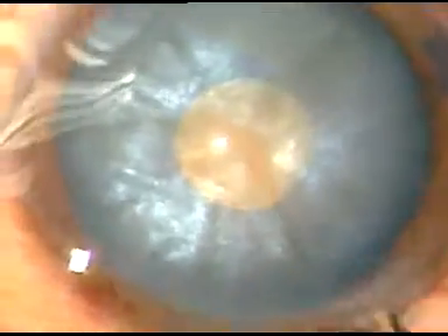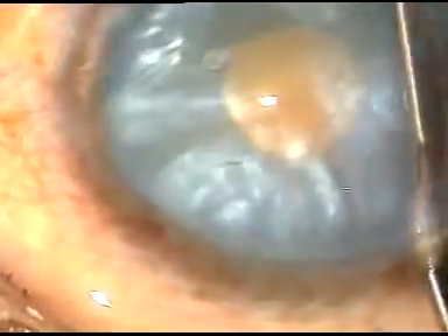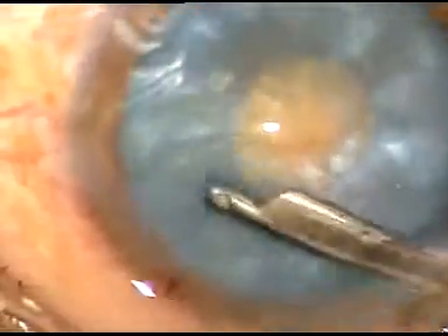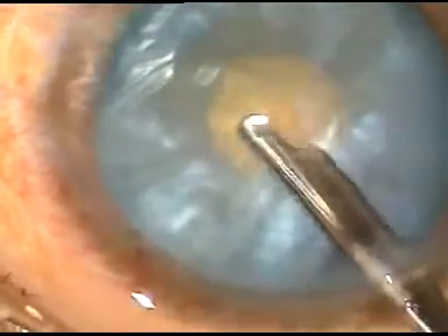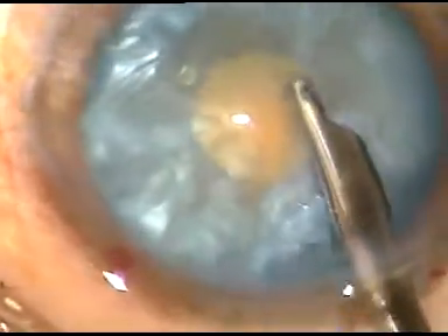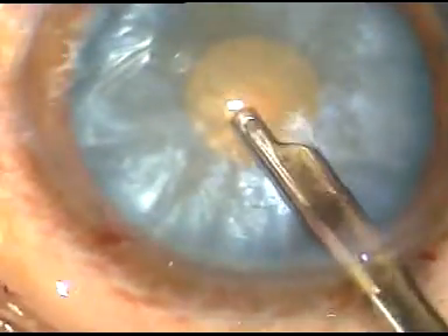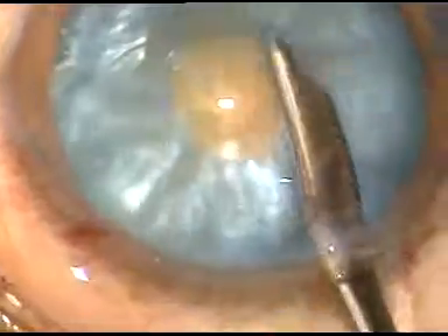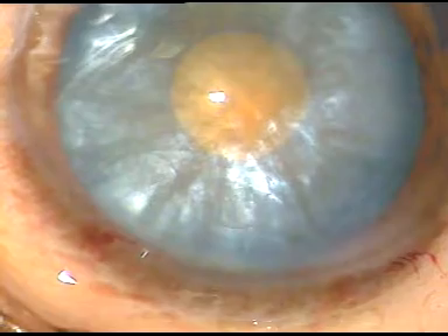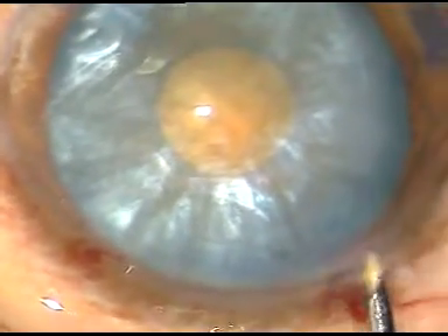Again, some peripheral cortical lens matter is aspirated through this small rhexis. If we can reduce the intralenticular pressure by aspirating some cortical lens matter, we have tamed this challenging intumescent cataract.